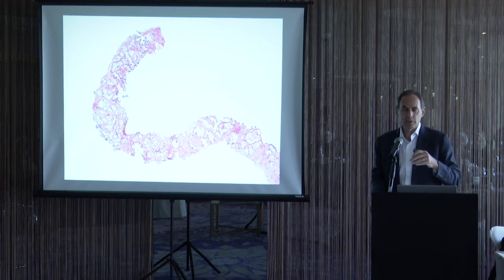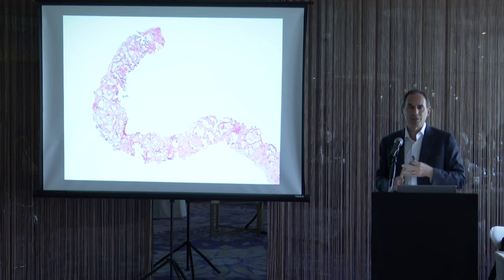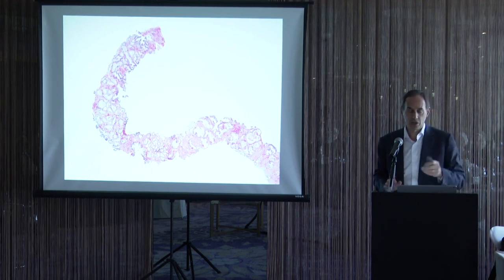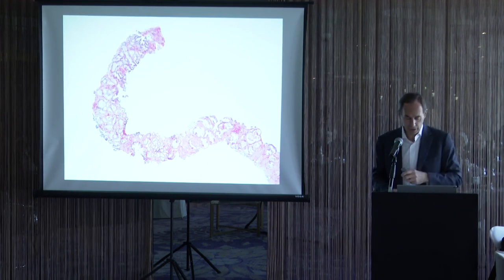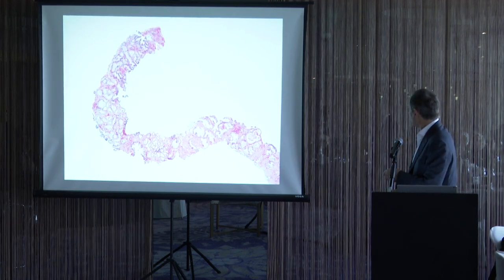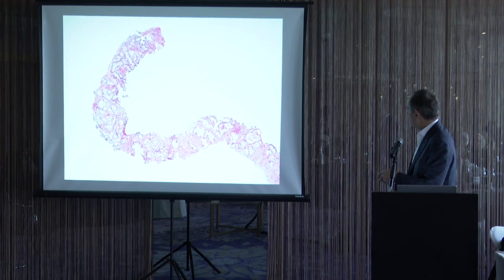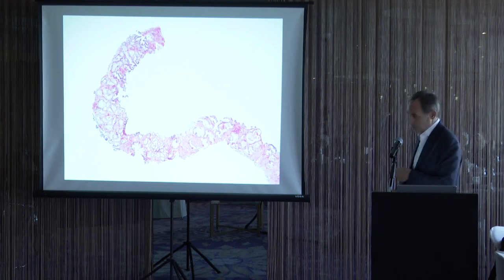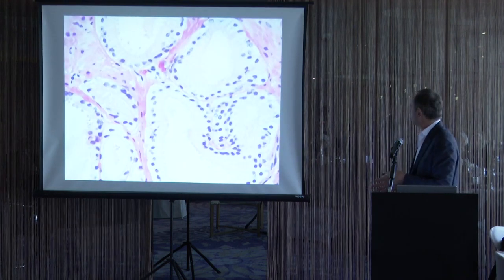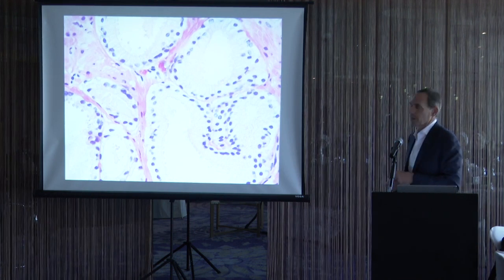But uncommonly, you can have a cancer that is very bland cytologically, where you have to make the diagnosis based on its architecture and with special stains. So here's a case where the lower part is more benign tissue. You can see larger glands, stroma, larger glands, stroma. Then we can see this crowded glandular process here that is suspicious for cancer. But when you go to higher power, it's basically very bland cytologically.